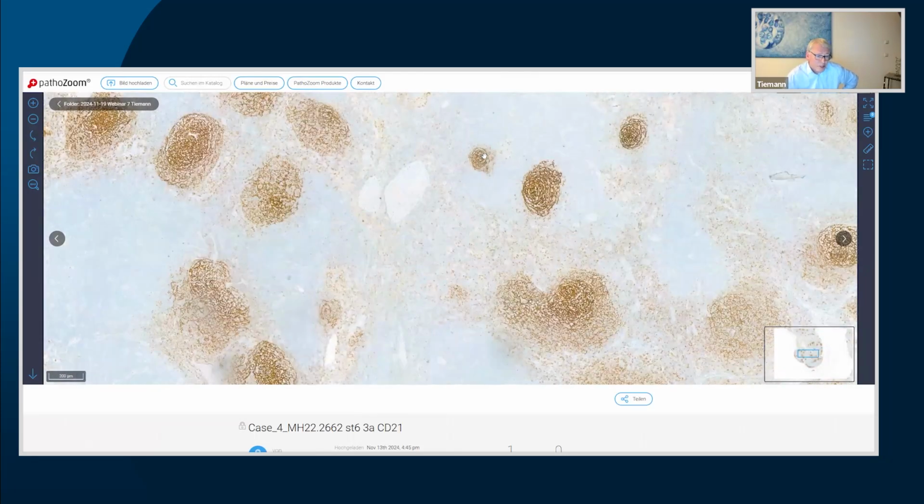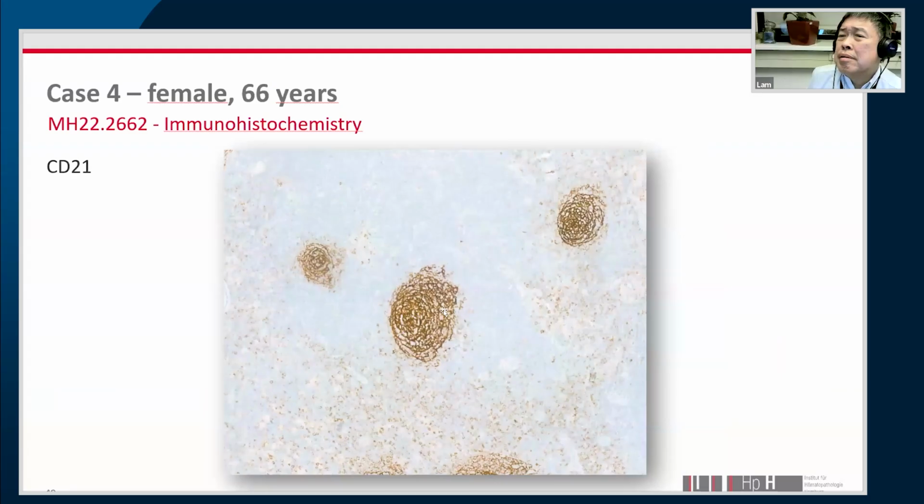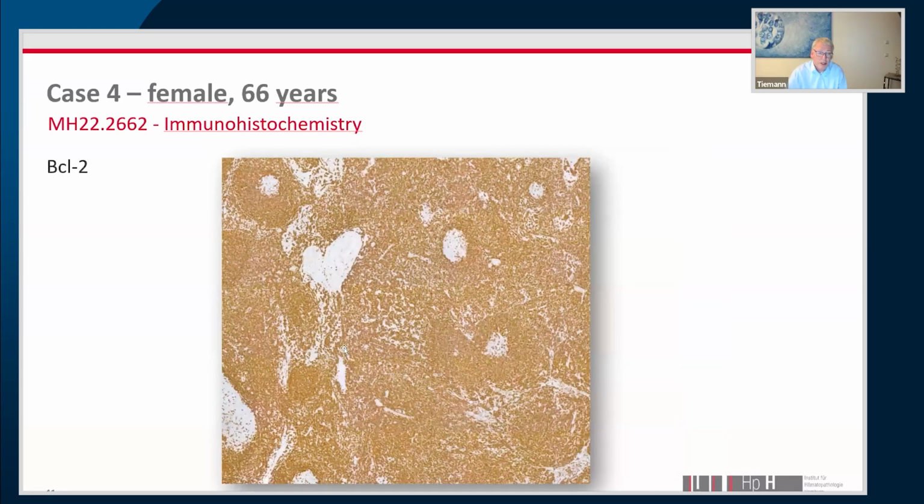And it's always difficult to decide whether this is a reactive lesion with some patterns of Castleman's disease or whether this is Castleman's disease. In multicentric idiopathic Castleman's disease, it's very difficult to find an exact border. You cannot count the number of changed germinal centers. You must take together every information you can get of the patient.